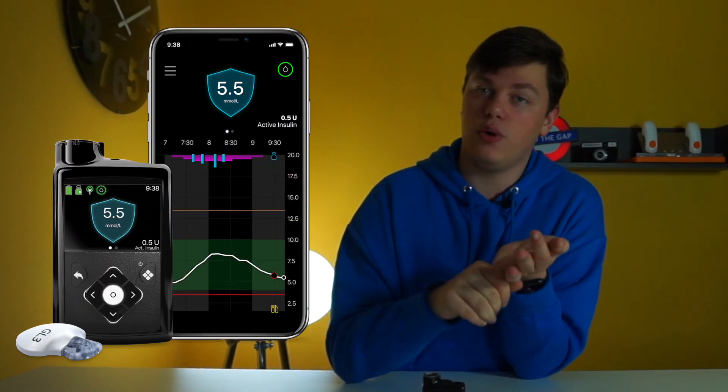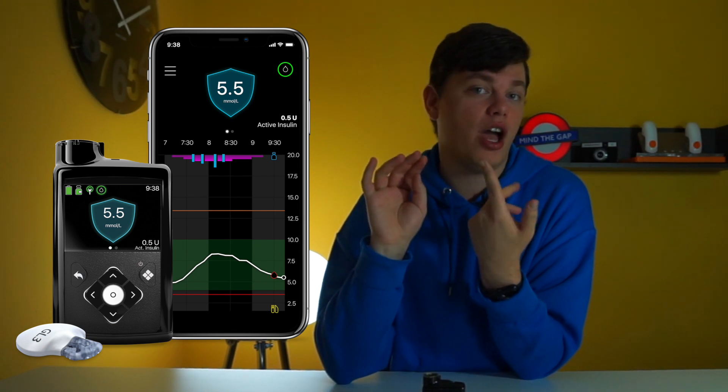The 780G also works over Bluetooth with the Roche Guide blood glucose meter. So whenever you need to calibrate or check with a finger stick, that data is synced automatically over Bluetooth from the Roche meter. So the 780G is a very significant update, especially because of Bluetooth — there's a phone display app, data sharing, a new algorithm with customizable target glucose, and correction boluses.